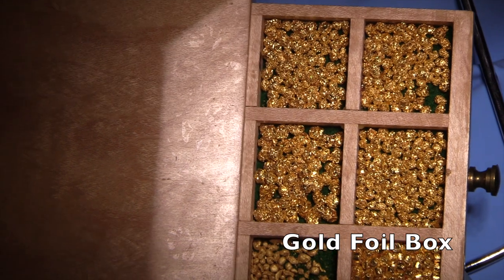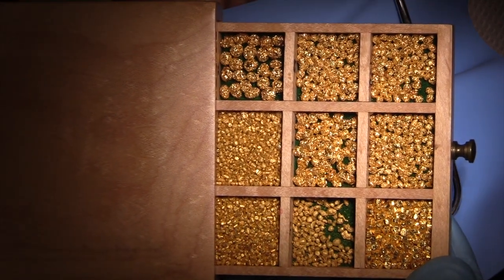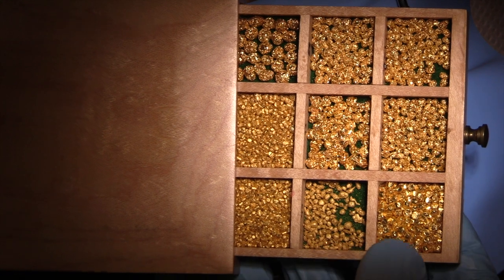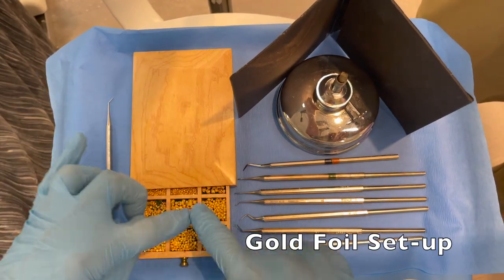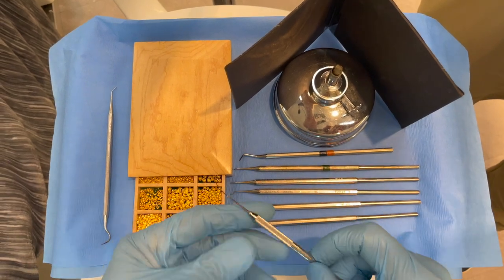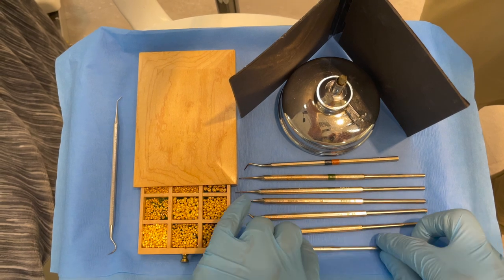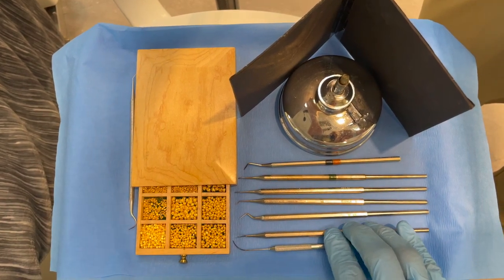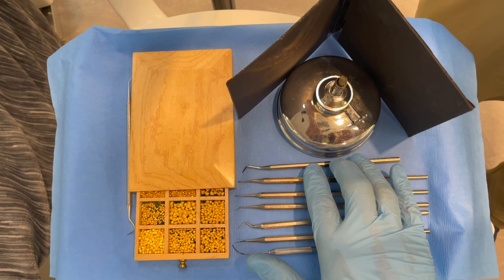After using 2% chlorhexidine, let's look at the foil options. This is my gold foil box — all these foil pellets were rolled by my assistant Millie, who's really capable of handling gold foil. I have different types and sizes. The ones we'll use today are easy gold, which is powdered gold wrapped in a gold wrapper, and gold foil pellets. I have a Woodbury-Myers instrument for passing; we heat the gold to burn off impurities — it's not the temperature but the effect of the flame burning off residual ammonia or oils. The other instruments are condensers of different shapes, and we use a pure ethanol flame to avoid contaminating the foil.